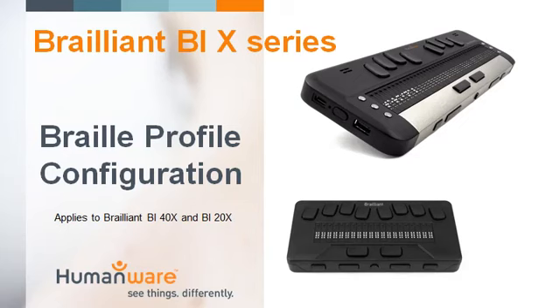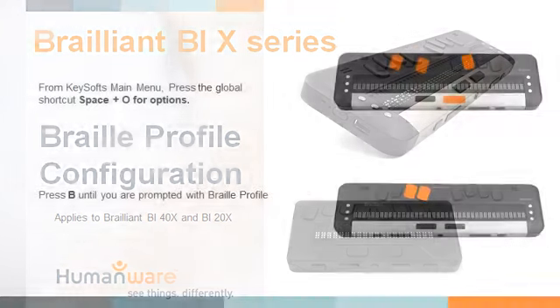So we're going to do this from the main menu. Considering that we are working in uncontracted Braille, I will show you how to configure the profile. And for this demonstration, we will be setting it into contracted Braille. We will be choosing UEB contracted Braille as our Braille code. I'm currently on the main menu.